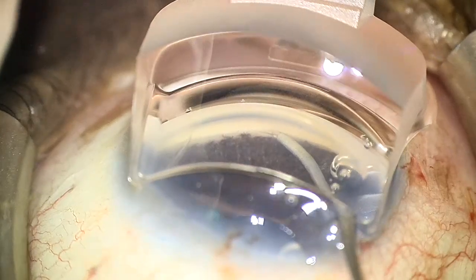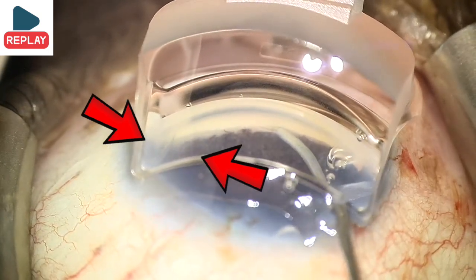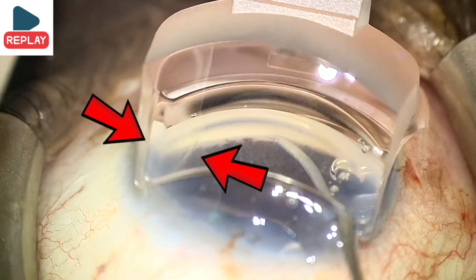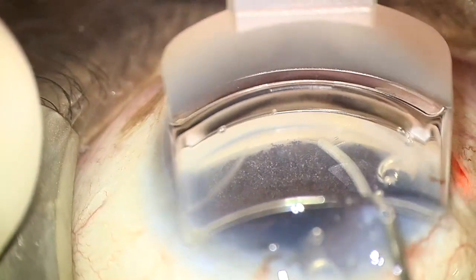The assistant clicks the visco-injector 10 clicks per quadrant, and unfortunately a Descemet's membrane detachment is noted superiorly. This was unusual because the AC was well pressurized and the catheter was moving forward continuously while the visco-injector was being clicked. Despite this, the catheter is still advanced forward, keeping an eye on the red blinking light.